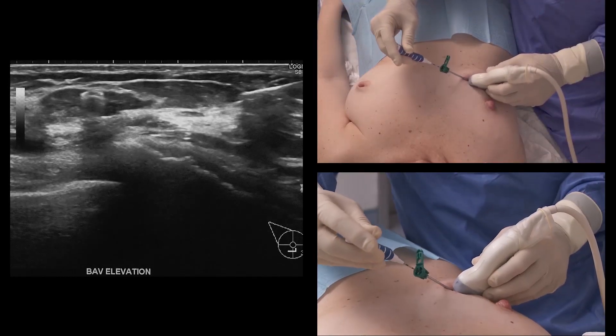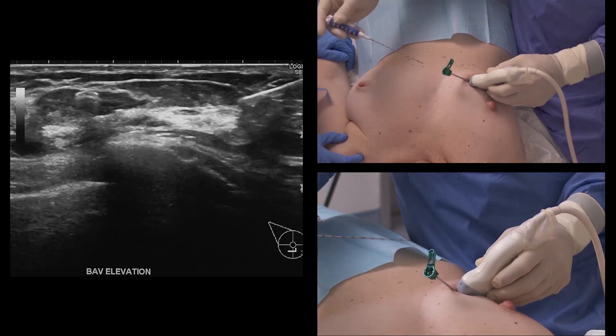After marking, remove both the applicator and the coaxial cannula from the breast.